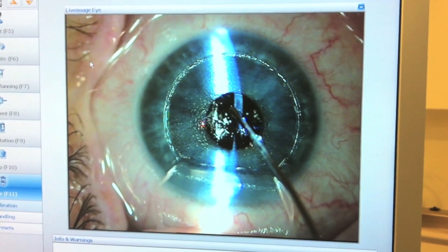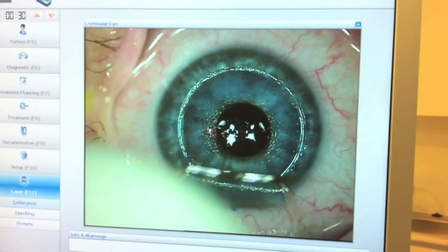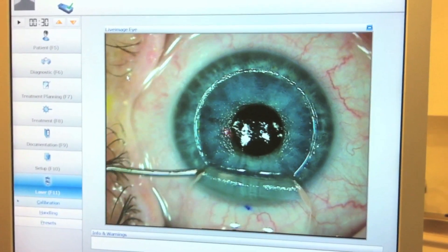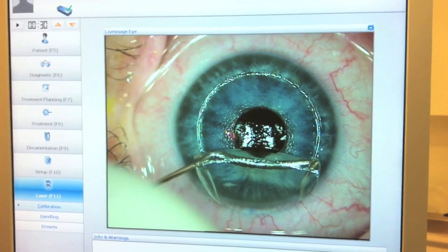Now using minimal BSS so as not to disturb the new position of the inlay, gently replace the flap. Ensure that the inlay is well positioned in terms of the corneal surface ink mark and manage the flap further as per the norm.